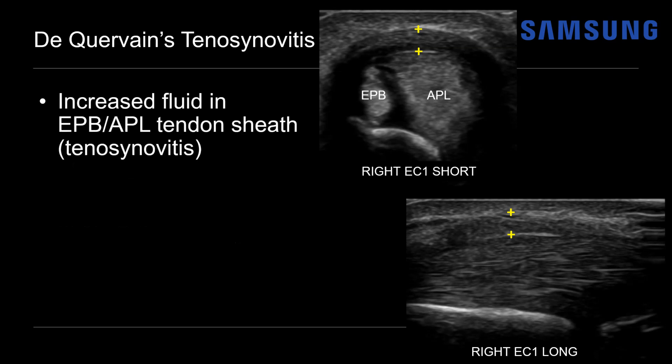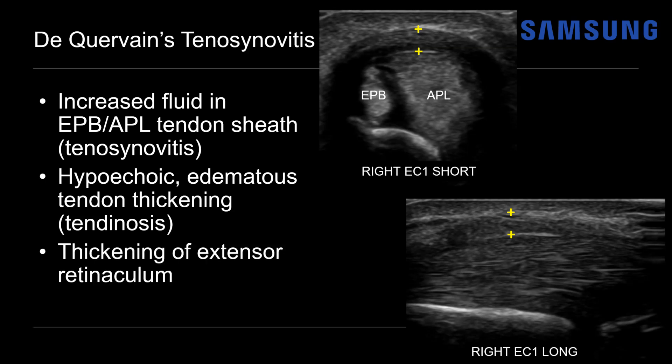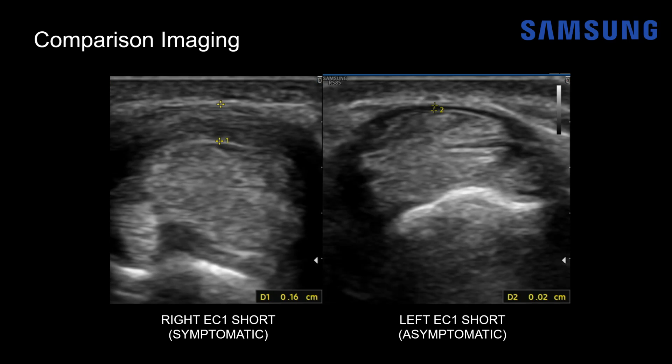On ultrasound we'll see increased fluid in the extensor compartment one tendon sheath indicating tenosynovitis — here we can see fluid surrounding the EPB tendon. The tendons themselves may become hypoechoic, edematous, and thickened, indicating tendinosis, and we'll see thickening of that overlying extensor retinaculum. Comparison scanning of the normal asymptomatic side is often quite helpful. On the symptomatic right side, the retinaculum measures almost 0.2 centimeters, while on the normal left side it's quite thin at only 0.02 centimeters.